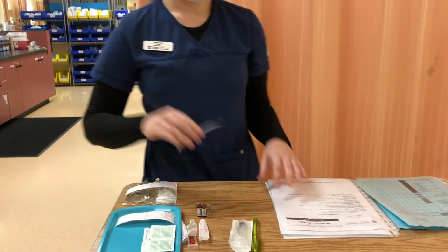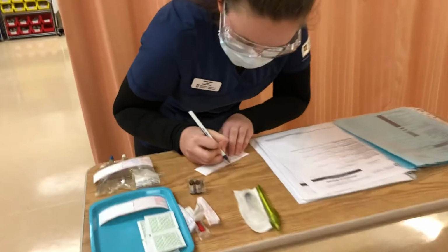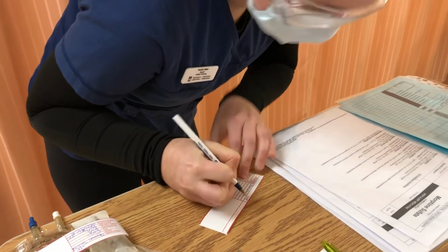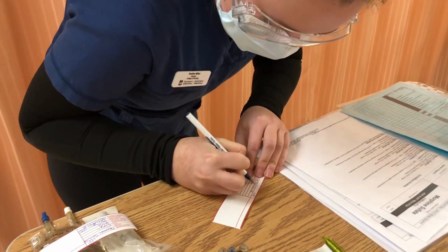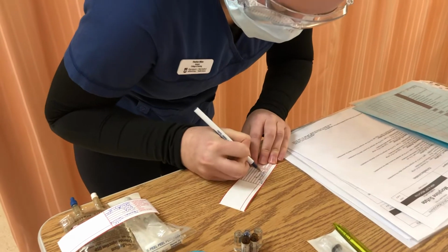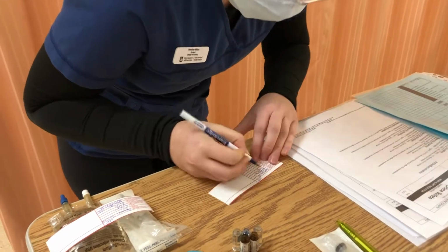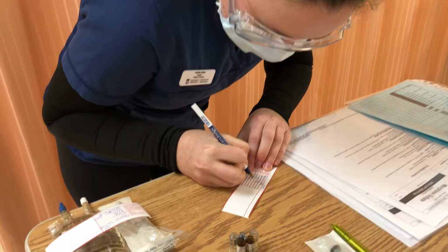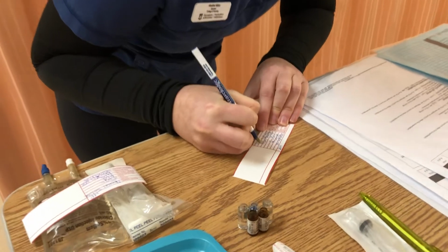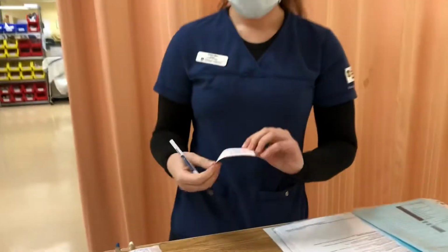Next, I'm going to create a medication label for the syringe that is going to pull up the medication. So this is for Marcy Paris. The drug name is morphine. The dose in the syringe is going to be 50 milligrams. The volume, because I'm pulling up 5 1 milliliter ampules, should be 5 milliliters. There's no diluent in the syringe, and the concentration is 10 milligrams per milliliter. It is November 20th at 13:30, and I'm Heather Milan, University of Manitoba student nurse 3. So that is going to be the syringe for that.